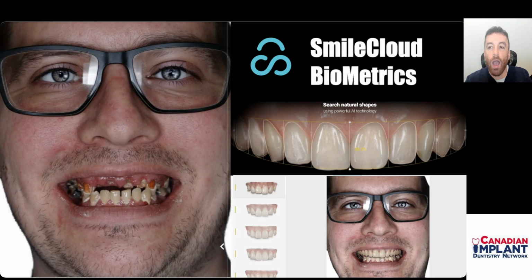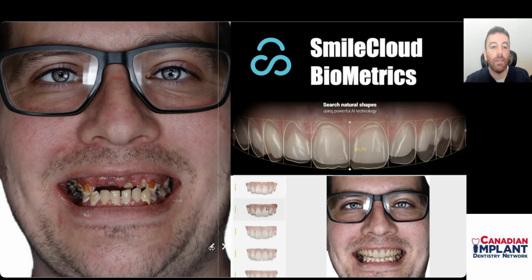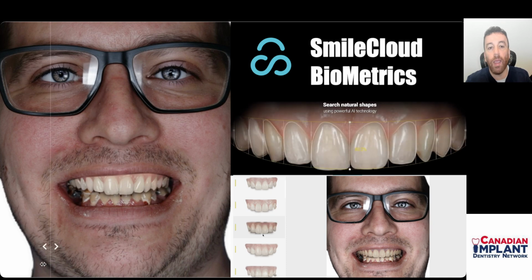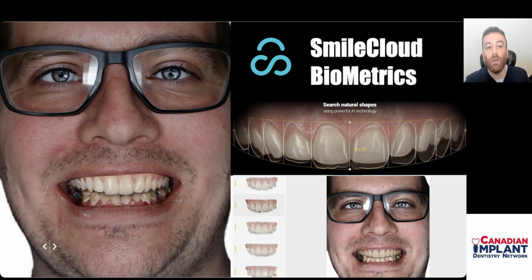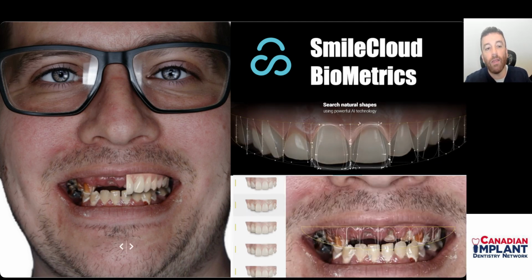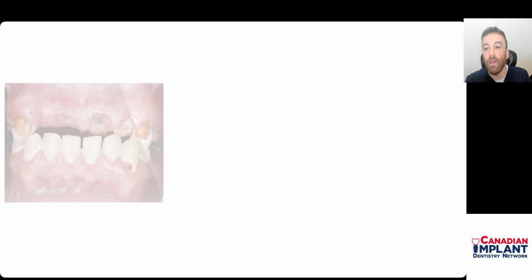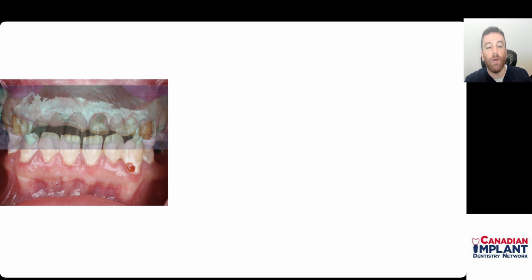So again, we go ahead and perform smile cloud analysis on our patient. This is not only a helpful motivator tool for patients to see before and after, but helps with our planning for our cases. Some of the concepts you'll see in this case date back to the PSI concept from 2019 under the Salama group. And the PSI concept involves partial extraction therapy and scallop guides in order to have a scalloped bone development of the case.